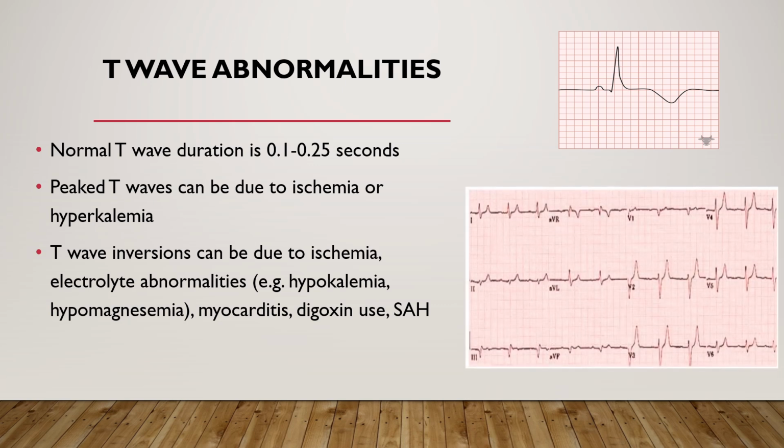And here on this pictorial representation of EKG, you see some abnormalities. On the top right, you see what is called a T-wave inversion or negative T-wave. And on the second EKG on the bottom, you see peaked T-waves.